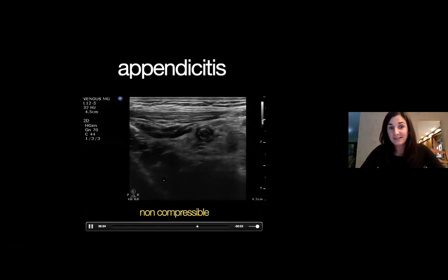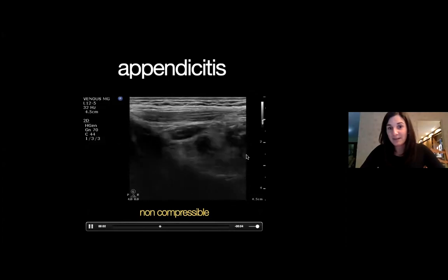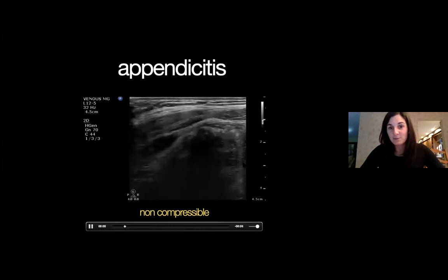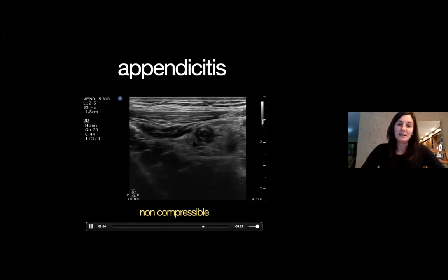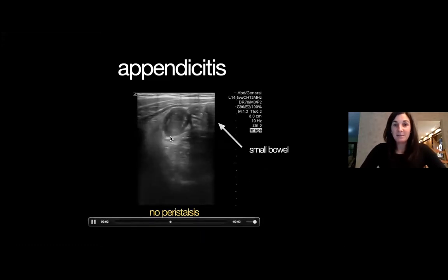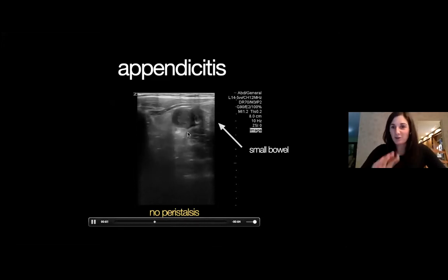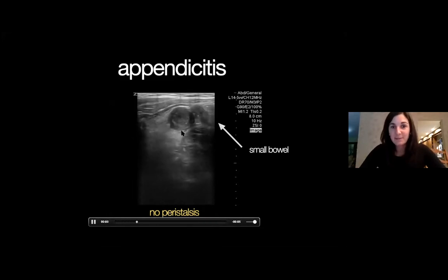Again, realize this is the iliac bone. You're going to have your psoas here, and your iliac vessels are in that area because you can see some pulsation right there. So you know that there are some iliac vessels in that area. So, a beautiful example of appendicitis, non-compressible. And again, be patient. This is something I did with children, just starting, when I was junior. I don't even know the date, but that is a big appendicitis right there.